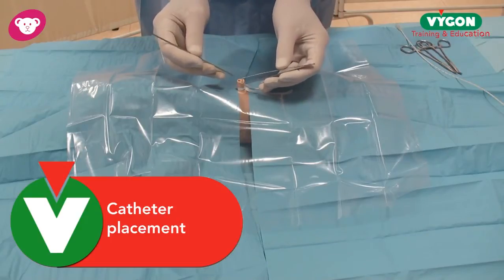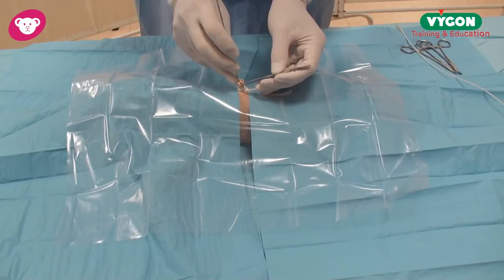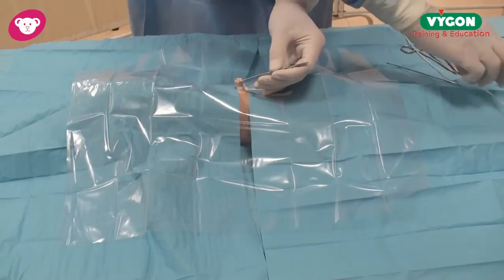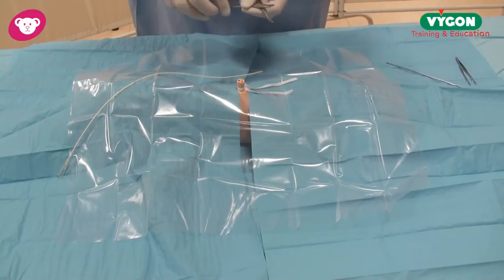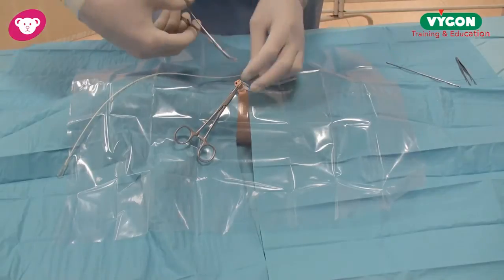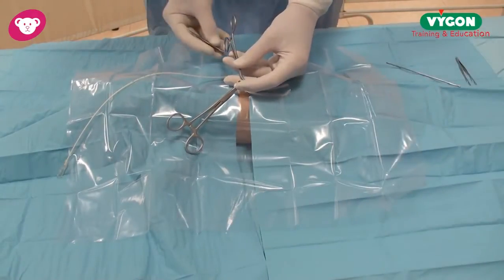After identifying the umbilical vein, I can grasp the umbilical stump with my two forceps and use the vessel dilator to dilate up the umbilical vein, making it acceptable for the chosen umbilical catheter. Once that is in position, I've already pre-measured my baby, and before I place my catheter, what is advisable is to use the forceps to grasp the stump — this stabilizes the stump into position — and now I can place my umbilical catheter into position.